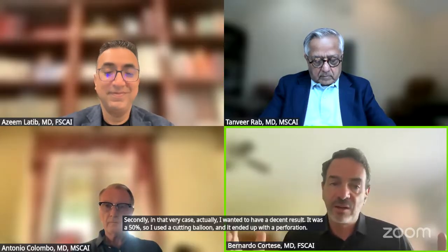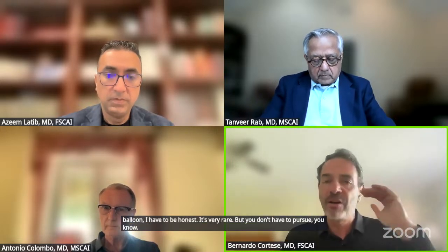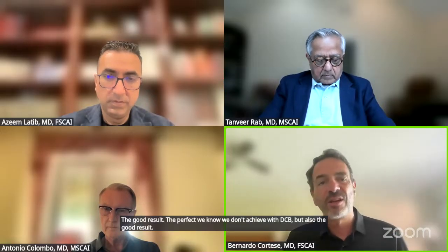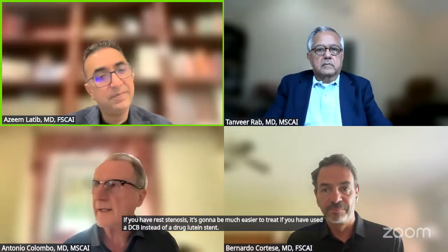Okay, so it's rare. It's my first perforation with cutting balloon, I have to be honest. It's very rare, but you don't have to pursue the perfect result, which we know we don't achieve with DCB, but also the good result. Sometimes you can also accept some residual stenosis. And if you have restenosis, it's gonna be much easier to treat if you have used a DCB instead of a drug-eluting stent.